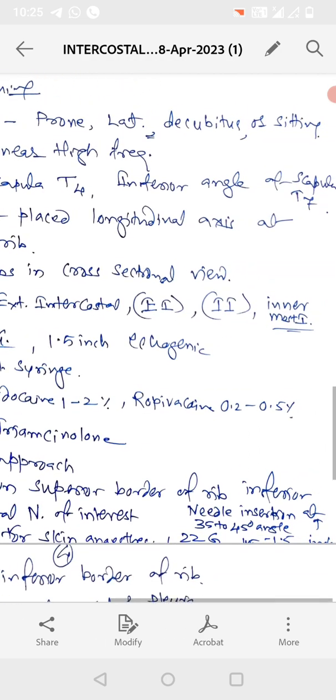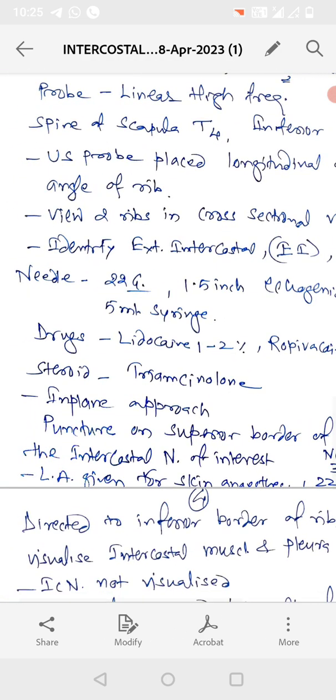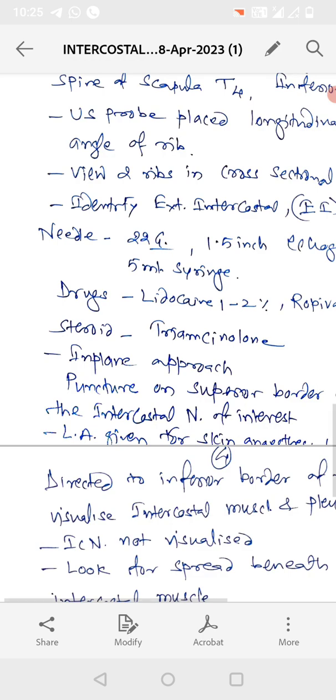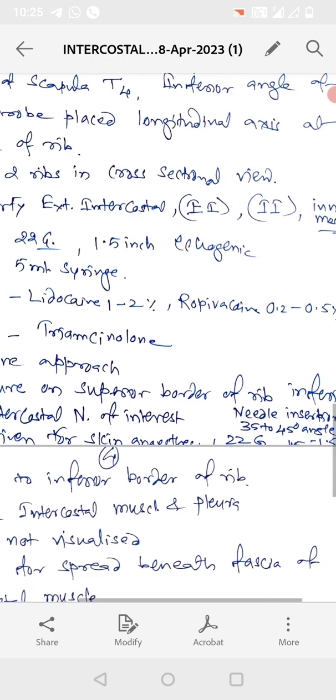The inferior angle of scapula corresponds to T7. The ultrasound probe is placed in longitudinal axis at angle of the rib. It views two ribs in cross sectional view.